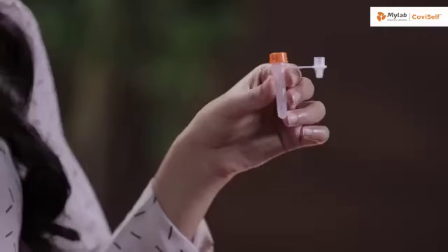Before you proceed with the test, please download the MyLab CoviSelf app either on Google Play or App Store. Fill in the credentials and then proceed with your test. The test preparations are now complete. Let's begin with the test.